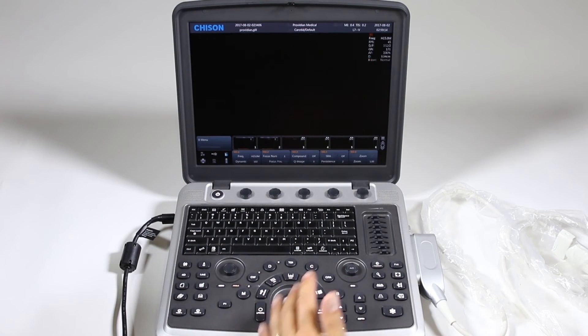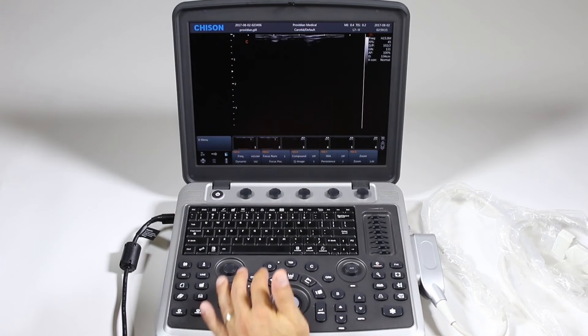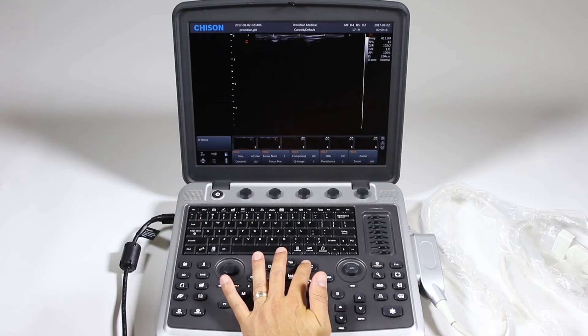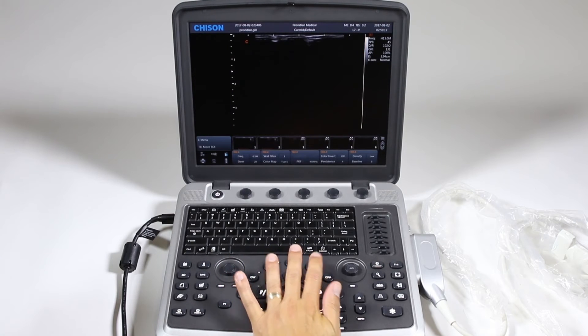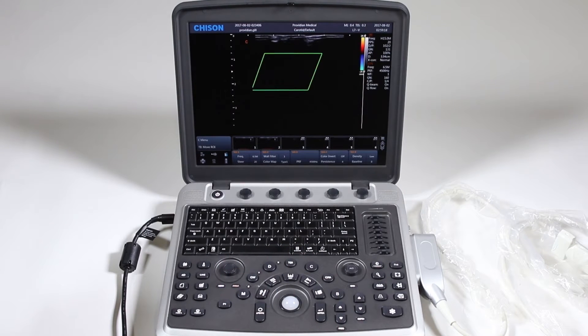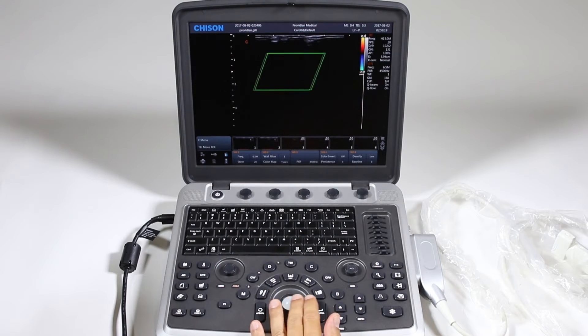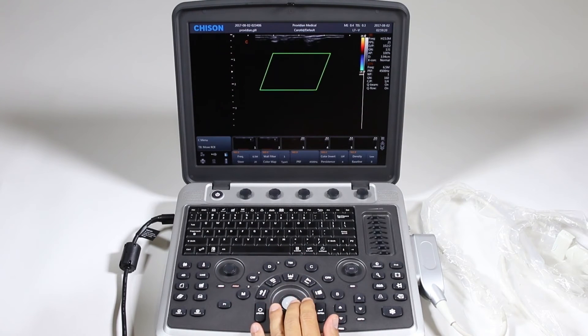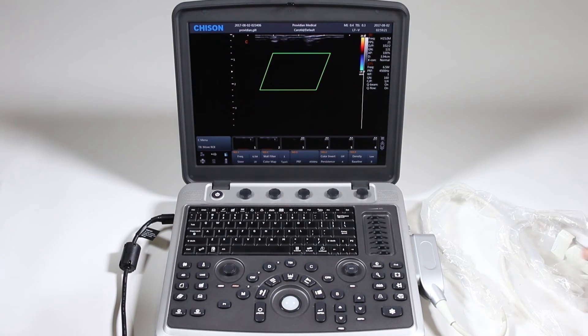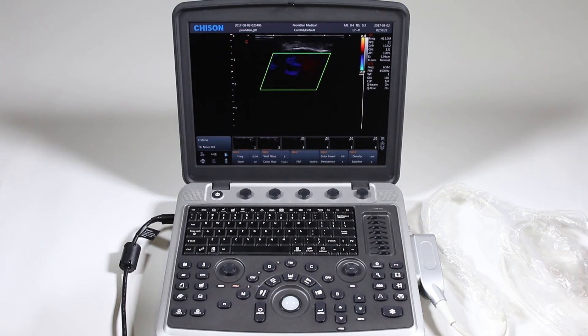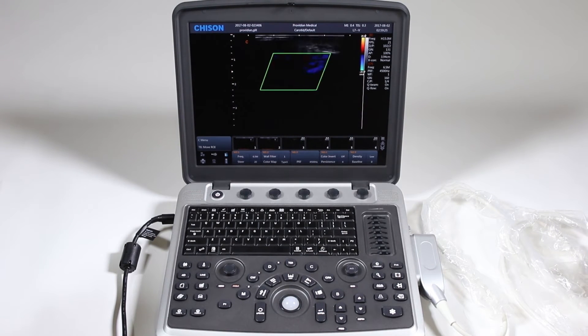Go ahead and go back to B mode and let's try color Doppler here. Just simply hit the C and you have your region of interest box right there and it just goes into live. There's no need to click update or anything of this sort.